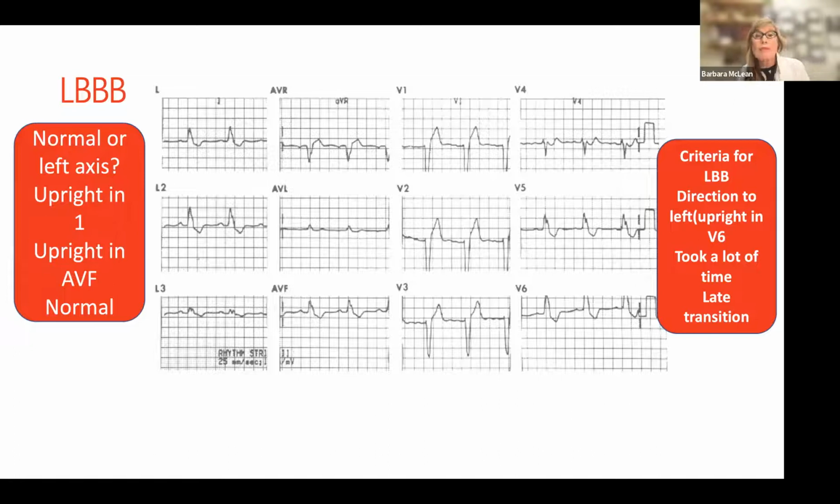But we actually have to look at how much ST segment elevation there is, and is it in the face of a left bundle branch block? If I have a left bundle branch block and I see this ST segment elevation, I'm not really sure. I might be having an anteroseptal MI. My patient's complaining of chest pain. By the way, I'm not going to activate STEMI, but I am going to call the cardiologist and ask them to look at the EKG. I'm going to leave it in the hands of the people who study EKGs, and that's what they do.